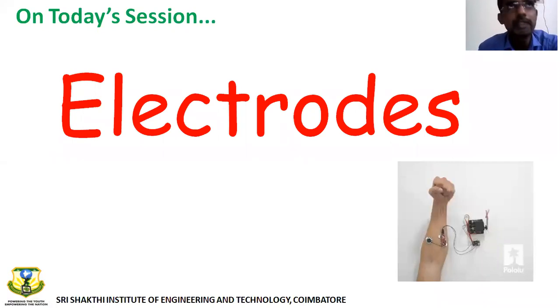Even in the lab, when you hold two wires of the probe, I told you in the first class that you will tend to read a signal. So even a metal can be an electrode. In most cases, it will be metal only. So you'll come to know that. Electrode is not rocket science. It is very simple. It is simply a metal, so that when you keep it on the body or inside the body, it picks up the signal.